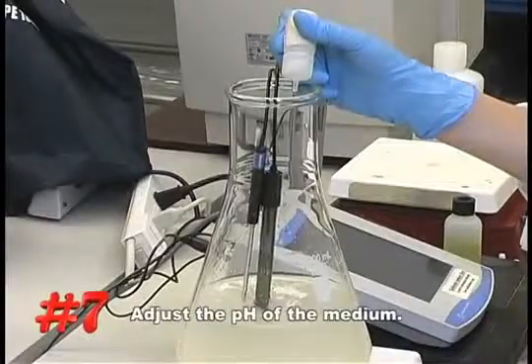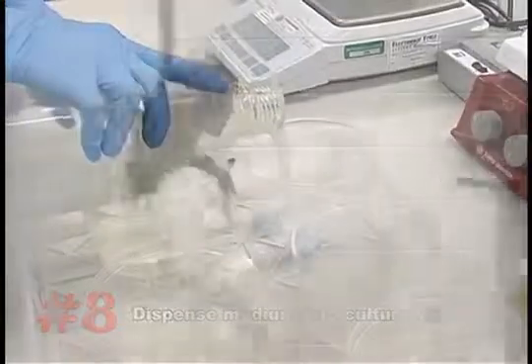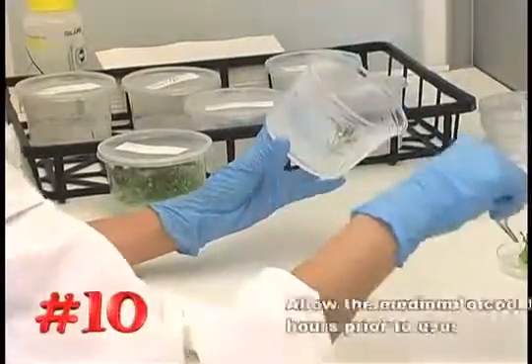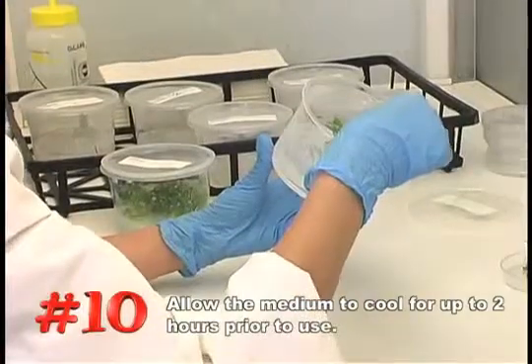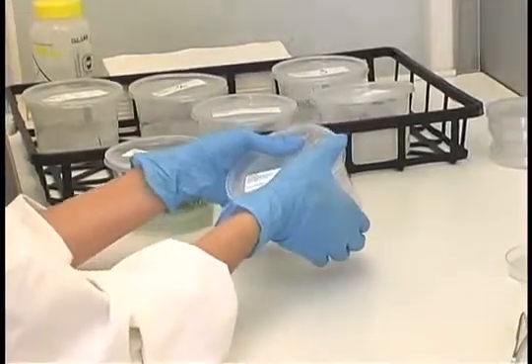Number seven, adjust your pH. Number eight, dispense into final culture vessels. Number nine, sterilize the medium in an autoclave or pressure cooker. Number ten, allow the medium to cool for up to two hours, or until the gelling agent is completely solidified, prior to use. Following these simple techniques should make your medium preparation process a success.